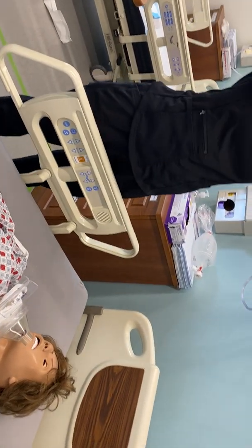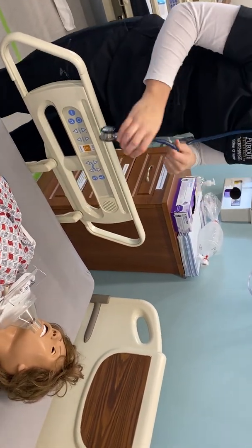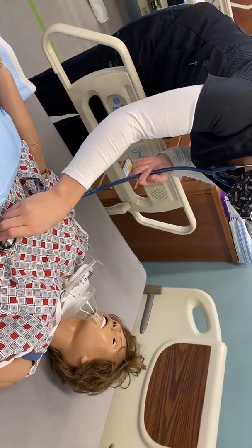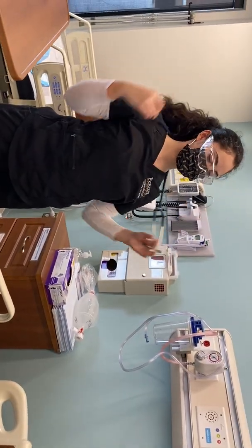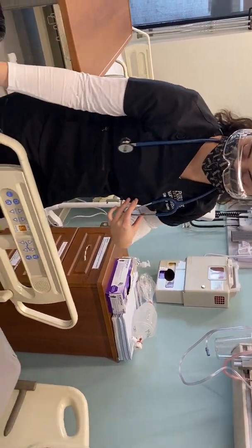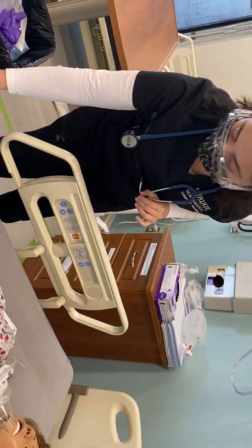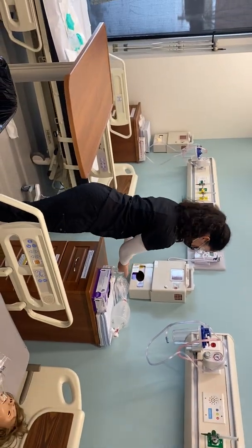Now I'm just going to listen to see if it is all clear. Okay, Mr. Jackson, it appears there are no adventitious sounds. It appears everything sounds clear. I'm going to put an oxygen O2 saturation monitor on your finger as well. Okay, your oxygen levels look within normal range as well, so thank you very much.